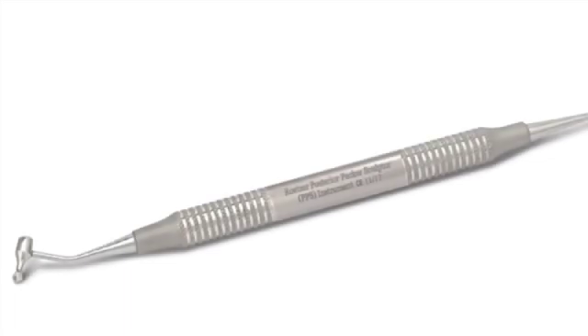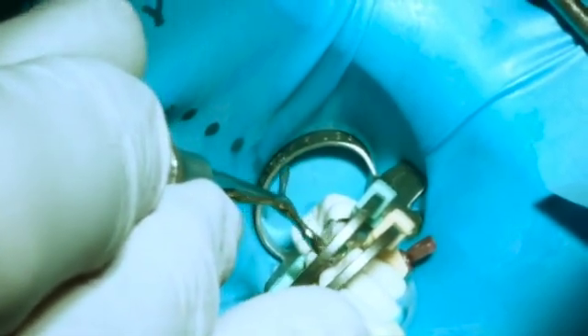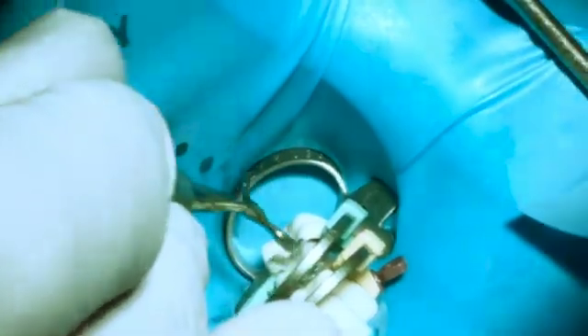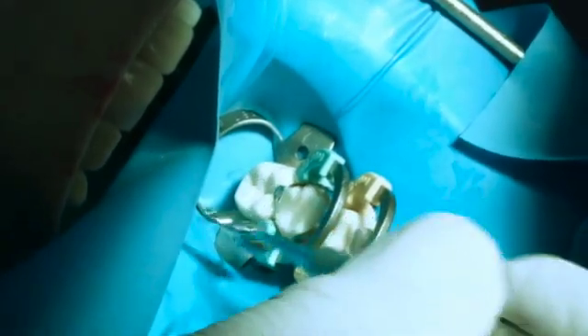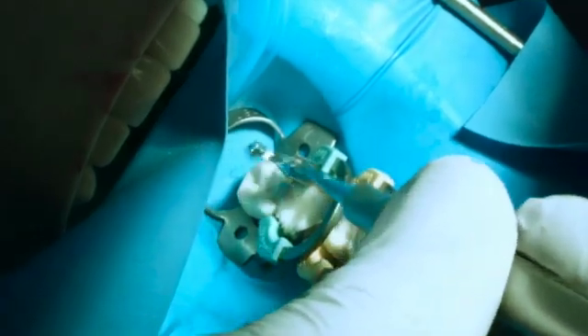After I pack that with the large packer and the small packer, I will have the material exactly where I want it. The other end of that instrument has a very robust ball burnisher and an acorn burnisher for the starting points of my hard sculpting. So here I'm pushing that paste into those nooks and crannies, rolling it over the occlusal portion of the interproximal area of the band, making sure there are no gaps anywhere.